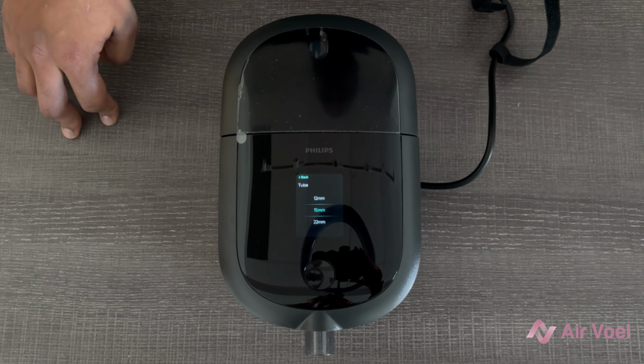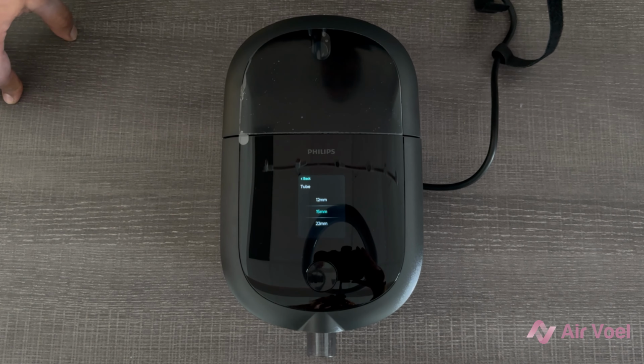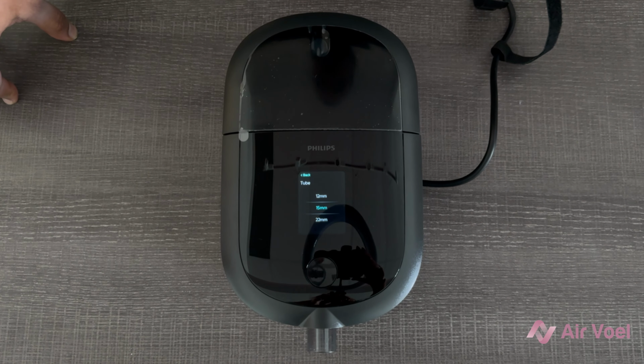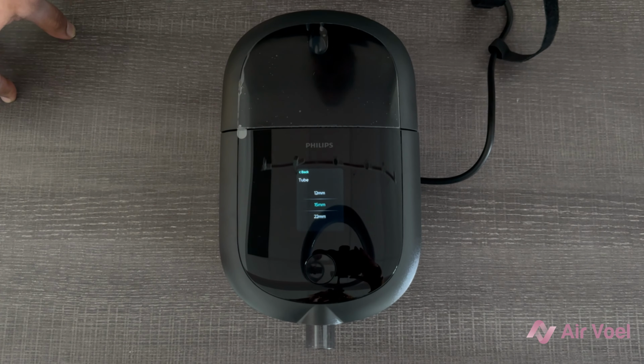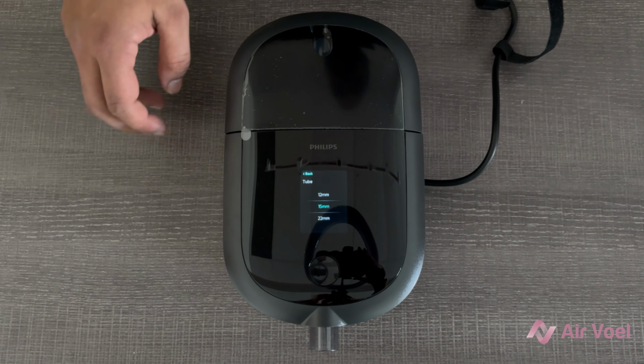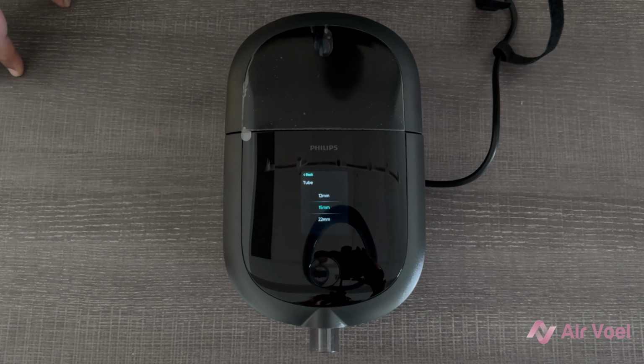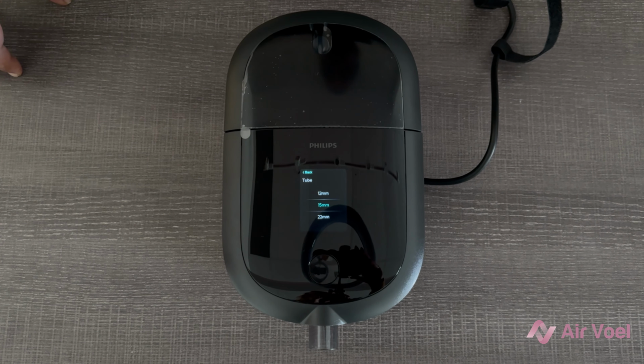After you set your exhale relief type, you will then be able to select the millimeter diameter of your tubing. The tubing that comes with the DreamStation 2 machine is a 15 millimeter tubing. However, if you use a thinner diameter tubing, the 12 millimeter option is available, as well as the 22 millimeter option if you're using a thicker standard tubing.